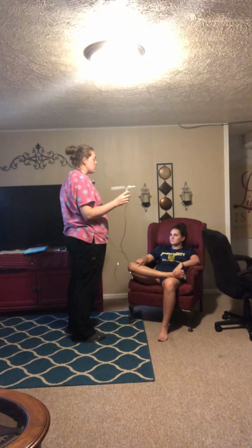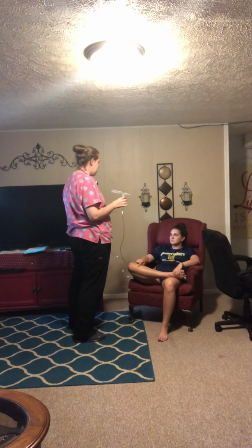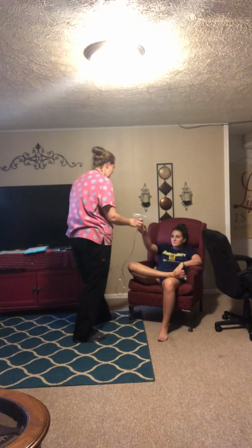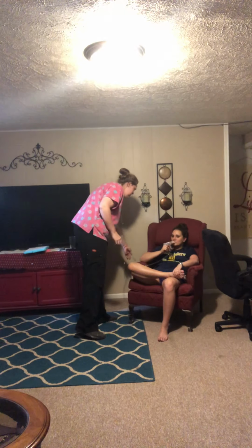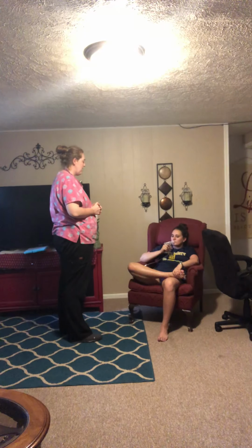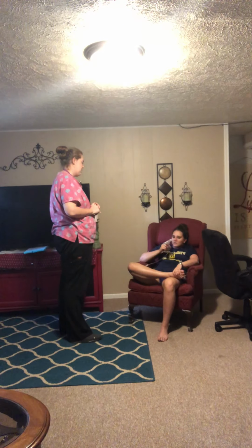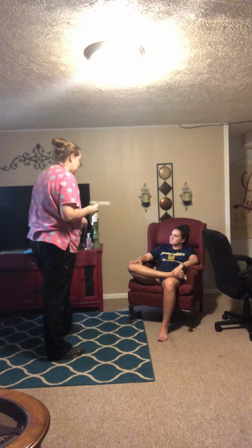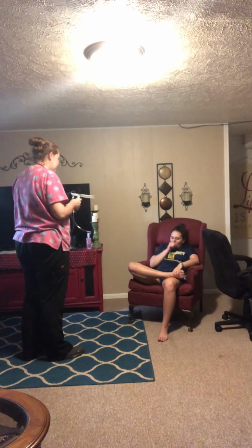Okay. So to use this, you're just going to go ahead and wrap your lips around the mouthpiece and breathe normally with that deep breath every few. Okay. All right. We'll just go ahead and do that. Very good. And just every few, just that nice deep breath and get it deep down in those lungs for you. Great. All right. Very good. Thank you. Can you go ahead and take a deep breath and then cough for me?